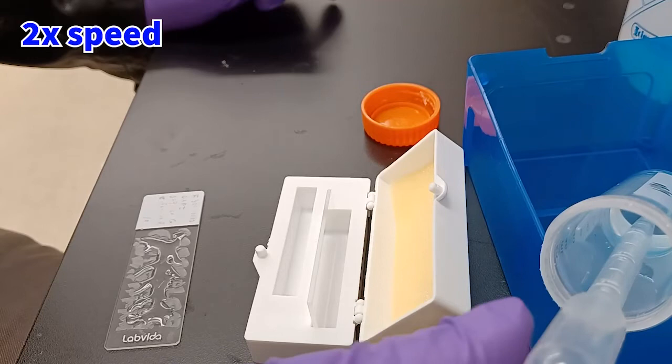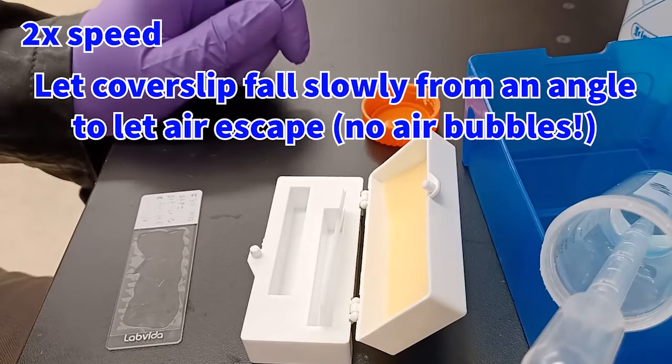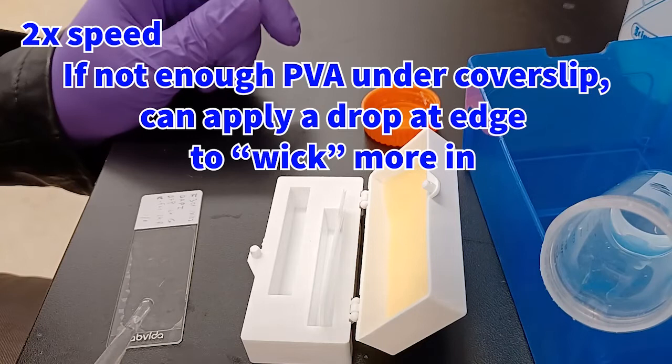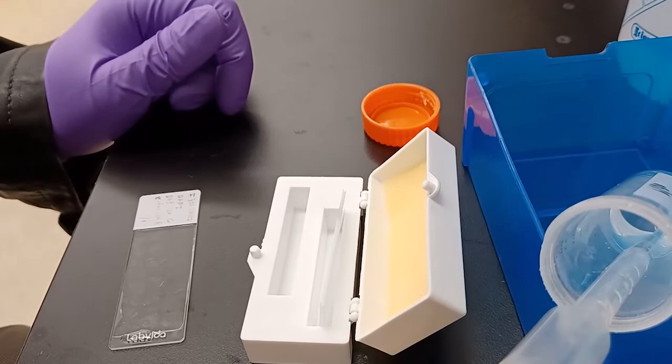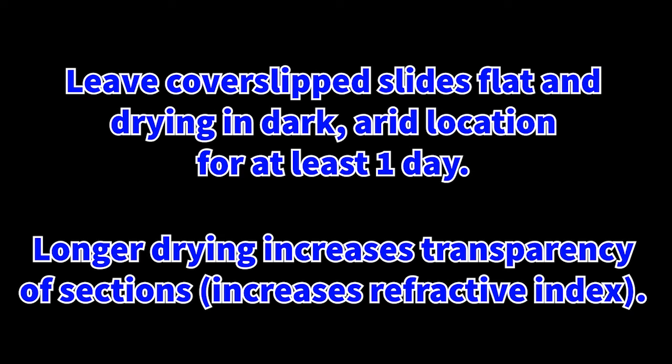When applying a coverslip, rather than laying it down flat, lay it down at a slight angle in order to let air escape from underneath it. If needed, you can lightly press on the coverslip to help the PVA spread out onto the slide and all the sections. If you find you didn't apply enough PVA medium underneath the coverslip, you can apply drops at the edges to cause some of it to wick inward and underneath. It's important to leave the coverslipped slides flat and drying in a dark, arid location for at least one day — movement or tilting might cause the coverslip to sag or fall off entirely. Leaving slides to dry for longer periods can increase transparency by increasing the refractive index as PVA dries out. Once the PVA has rubberized around the edges of the coverslip, the slide should be ready for viewing under an epifluorescent microscope.